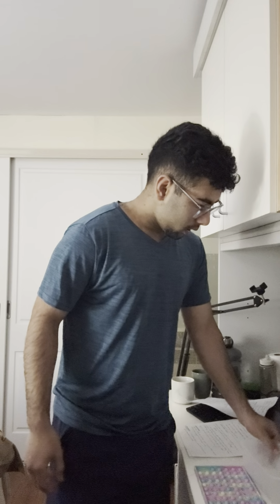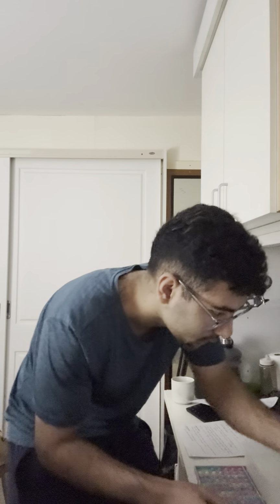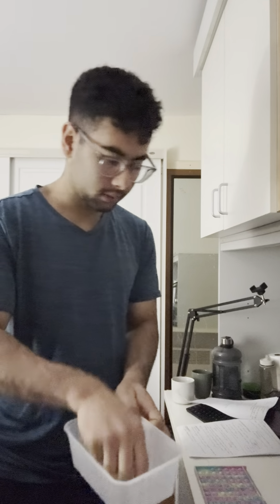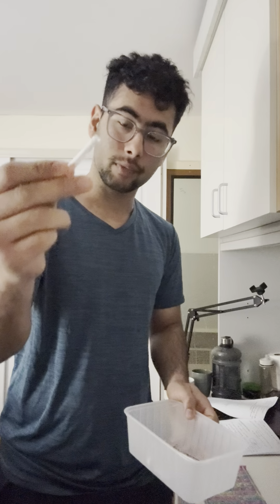So once that's done, I thought I had the insulin syringe here till yesterday, but right now I don't have it, so I'm going to use this random syringe for now, just to give you an example of how to do it, right? So you need this syringe. I already took it out of the packet. This is the needle. Take it out of the packet.